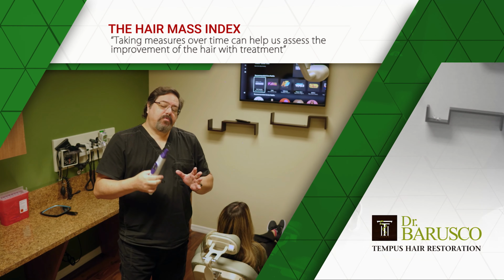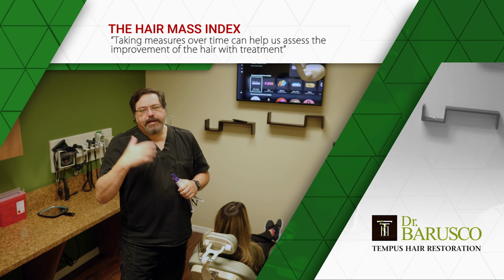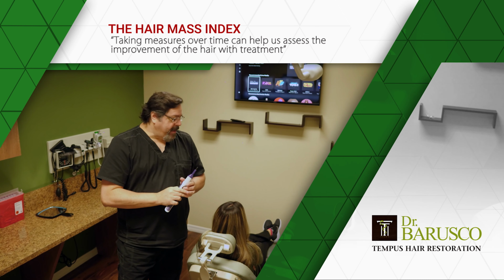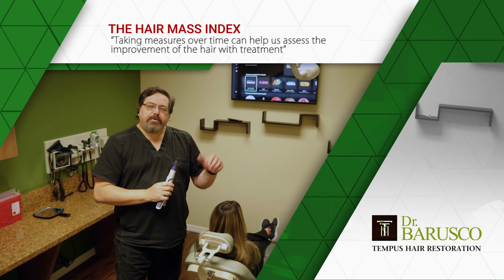But when we start the treatment for her, the medications and everything, in a few months we can bring her back, measure the same area here, and we will see if the numbers are going up or going down.